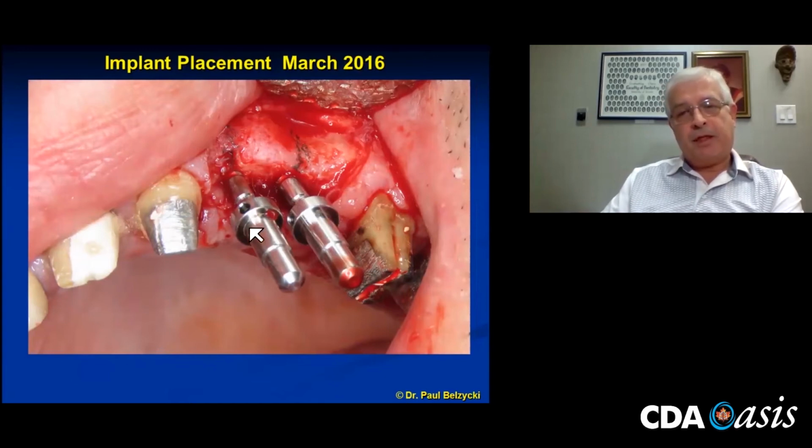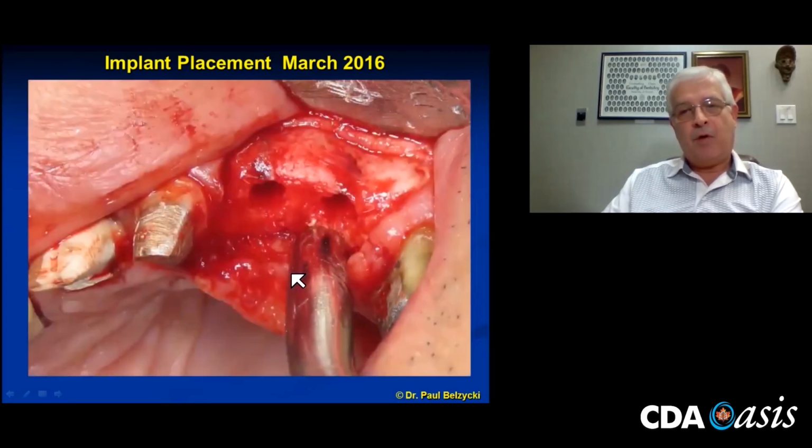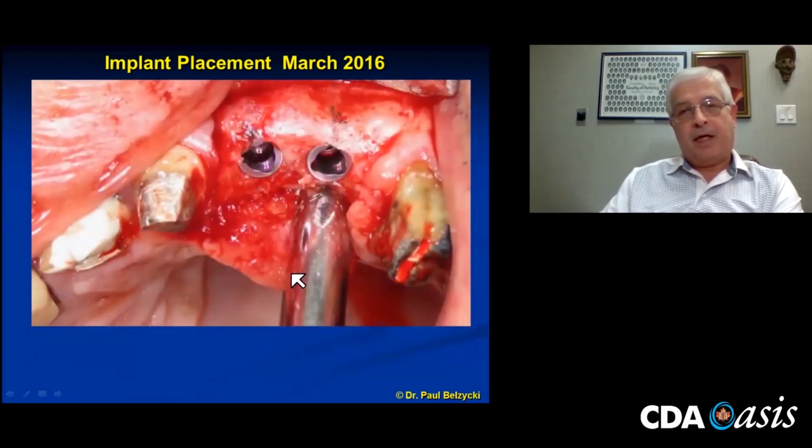Time of surgery, these are the photographs I've taken. As I said, I attend all of these surgeries, and nothing more sophisticated than two little pencil lines, kind of guides where the implants go. And as I've said before, I love these sorts of pictures.